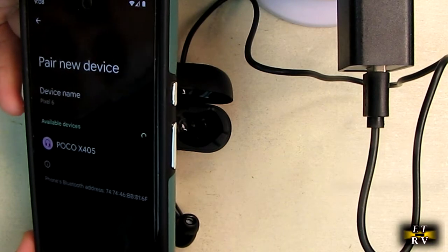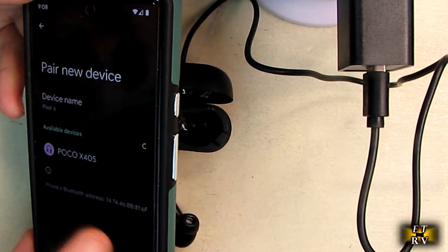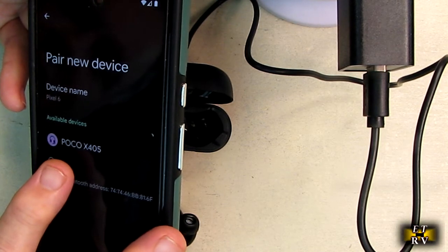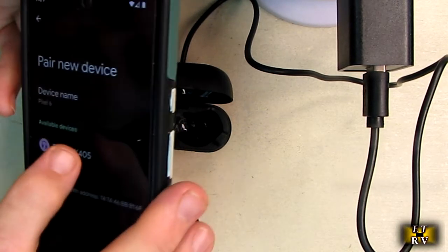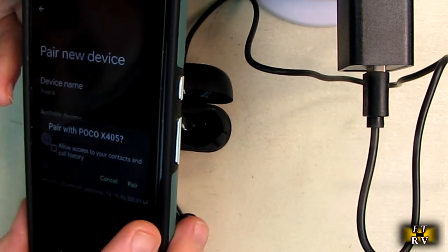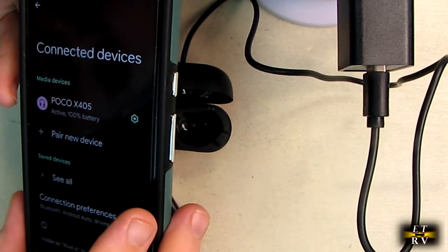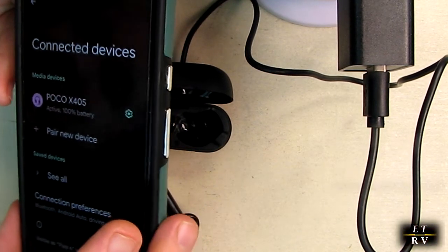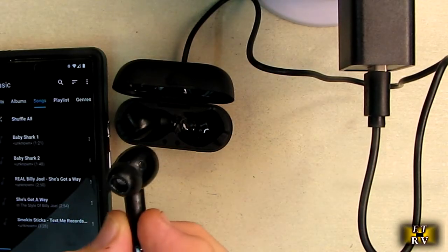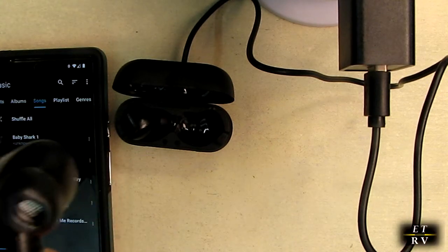I have my Pixel 6 right here. I said pair new device and it picked up POCOX405. I'm going to assume that's this device, so let's pair to it. It says active, 100% battery, so it's giving me battery information. That worked—I can hear music in here. Let me put it by the microphone.